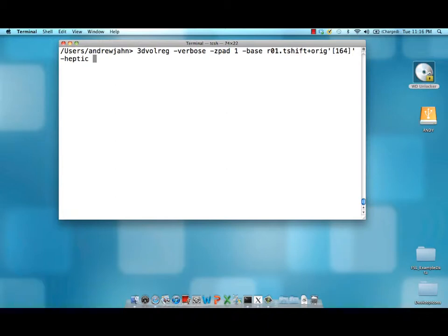So I'm going to use heptic. AFNI's 3D Volreg is very fast so don't be afraid to use a higher order interpolation method. Either heptic or even Fourier is fine.